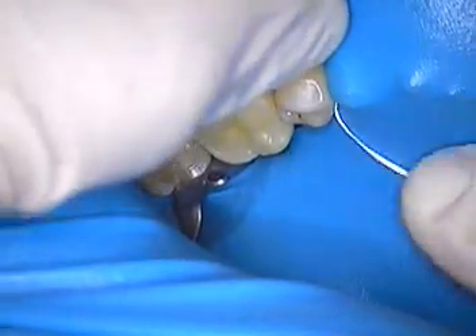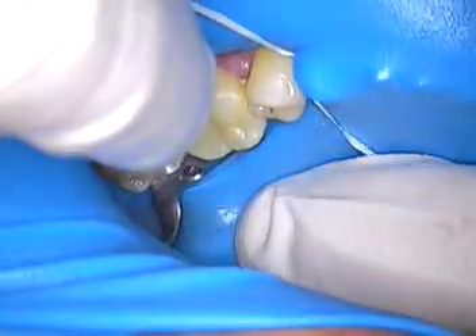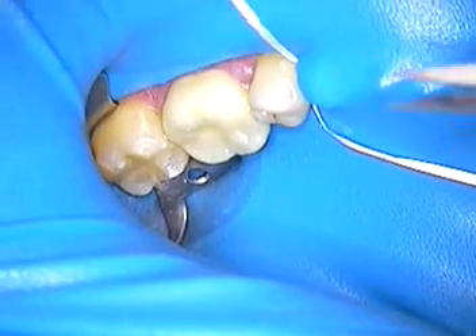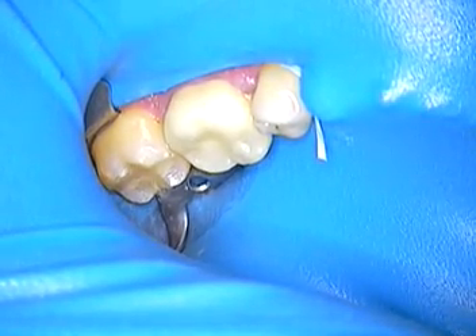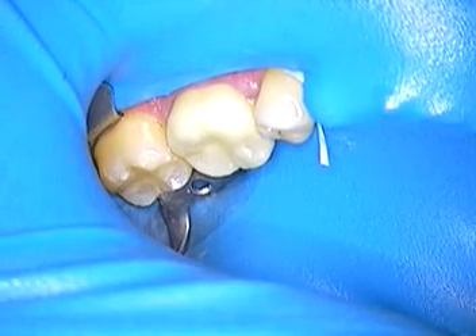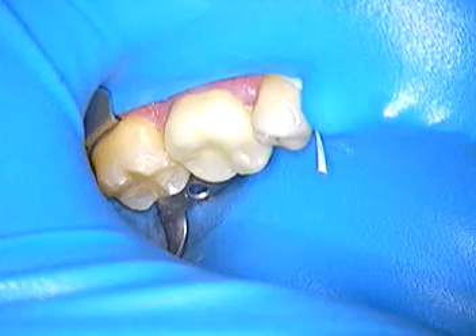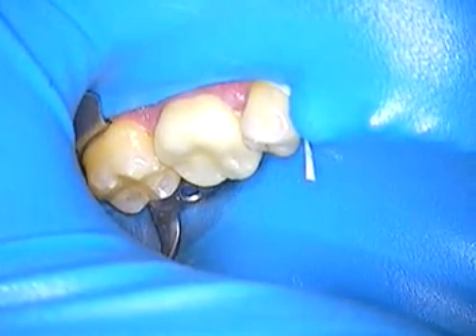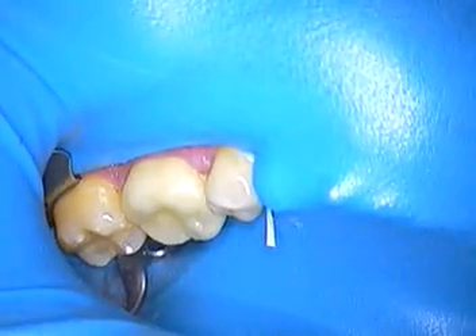First things first, I want to place a little ligation here. He's been very patient through this ordeal — this hasn't been an easy process, and it's kind of a discovery as we go. Basically, he's got a distal root that has an abscess from an ill-fitting old root canal, and the dentist that placed the restoration placed a cast, non-precious post and core after the root canal was done and, of course, the crown. So we had to take the crown off to expose the post and core. We subsequently had an endodontist make an attempt through the crown, but it was futile, and so he decided to condemn the tooth. And Pierre and I decided we're going to try to see if we can do this right — if we can restore the tooth.